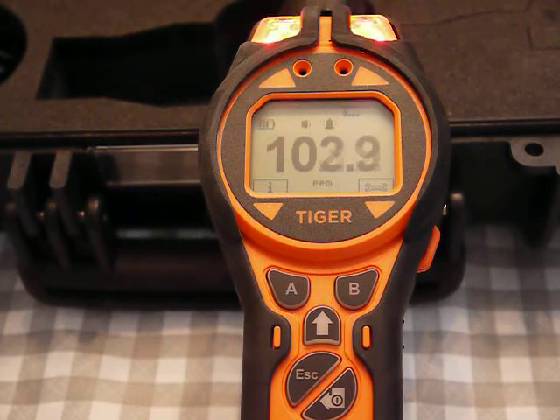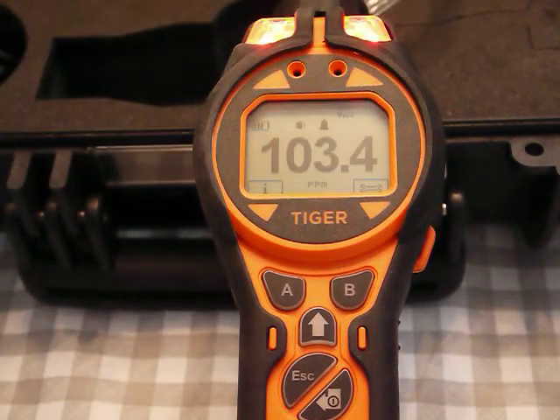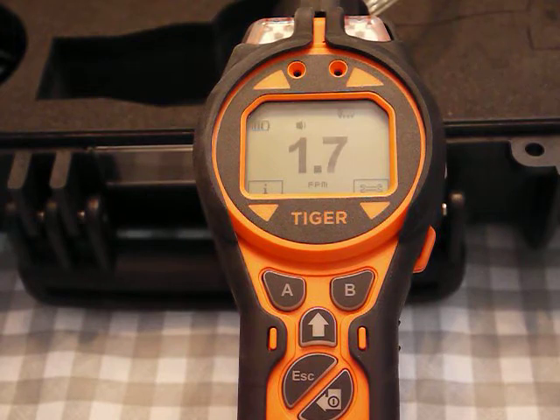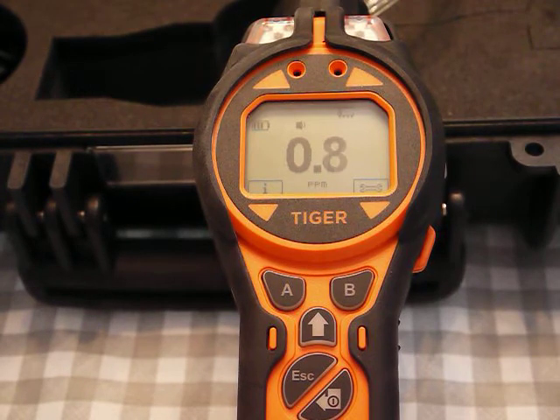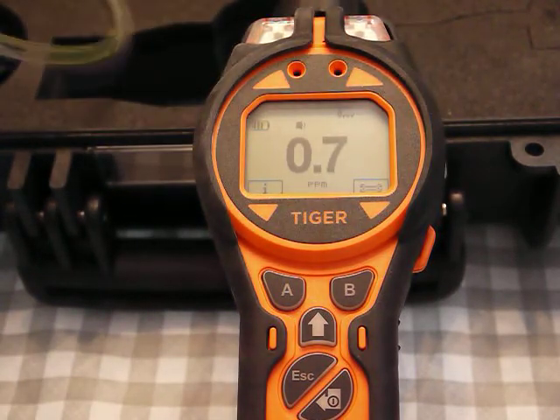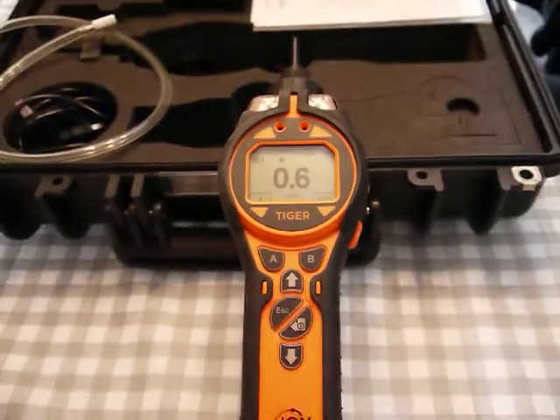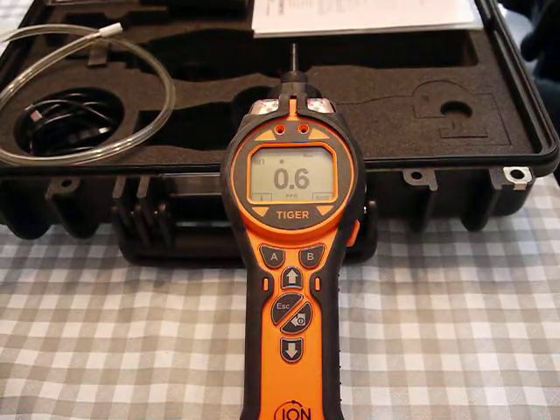If I turn this on you can see it go up — pretty close, not bad. But I'm going to calibrate. If I remove the gas you'll notice with PIDs generally they zero out pretty fast — this has returned down to pretty much zero.